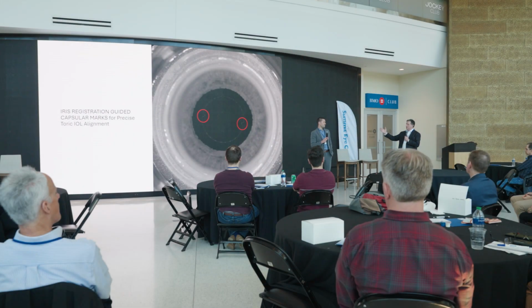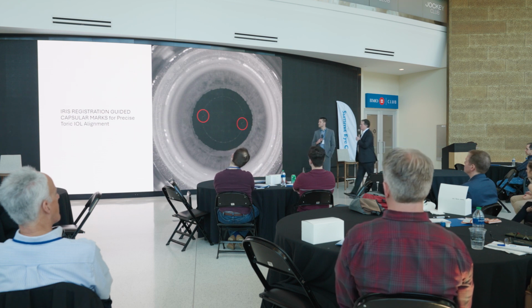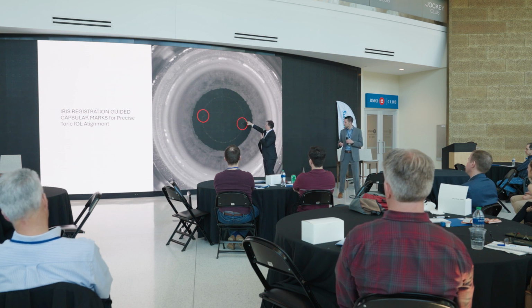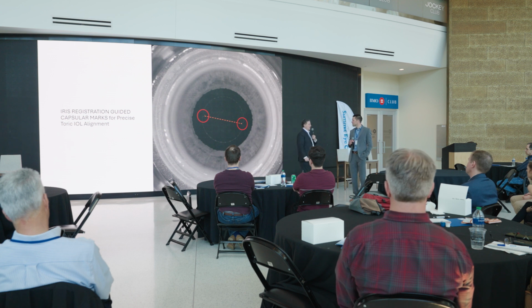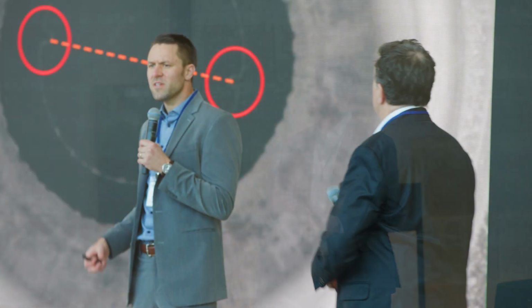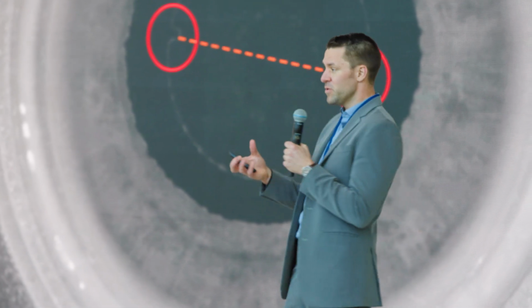Now we're using the femtosecond laser, and we have these absolute references at the plane where the implant sits, this area that gives us exactly where the implant goes. And that is how we get spot on toric control. It's really changed my opinion of toric lenses, in all honesty, because we can be accurate at a level that we never could before. Yeah, it seems like a very old school way of doing it, but that's how we've done it up until now, which is crazy to me.